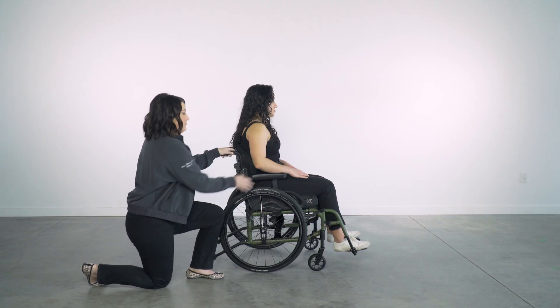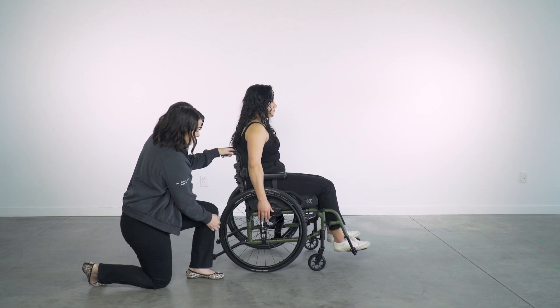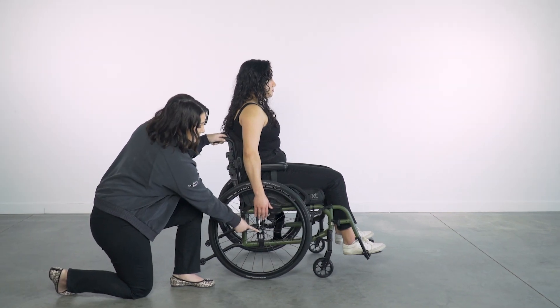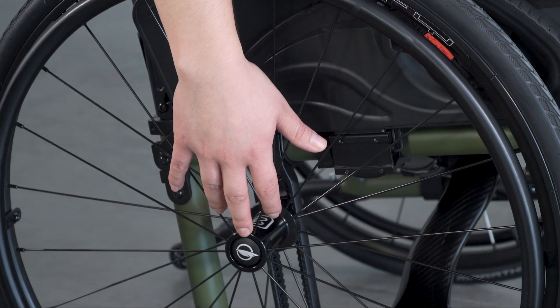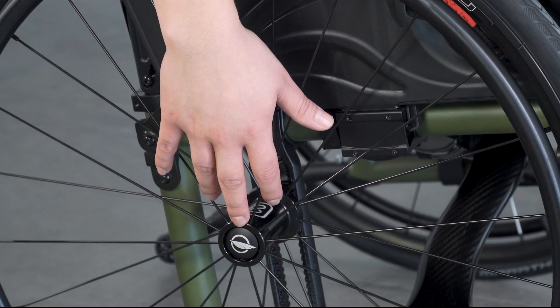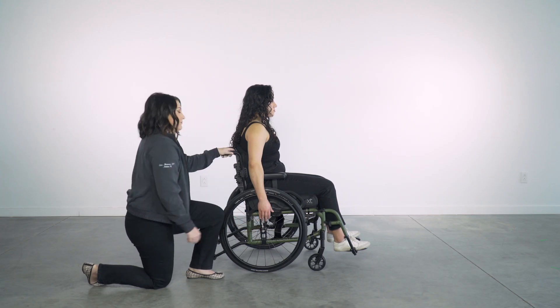To check vertical axle height, have the client place their arms down at their side over the rear wheels. You will want to pay attention to the center of the axle and their middle finger — it should land on or near the axle. In this setup, you can see that she is too high in the frame of the wheelchair. This is not a proper setup for efficient propulsion and further changes need to be made.